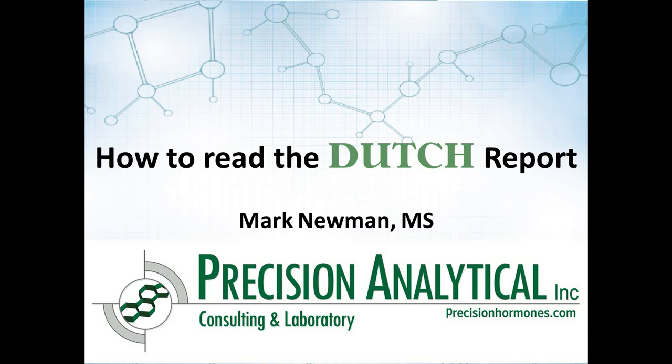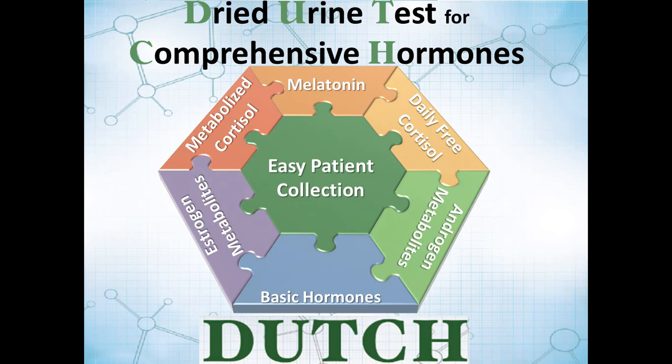This tutorial video from Precision Analytical is intended to assist you as you interpret your report for results. This is intended for providers to assist with their interpretation. If this is shared with patients, that's great, but do be aware that none of the comments from us are intended to usurp the role of the healthcare provider in that process. So do refer your questions as patients back to your healthcare provider.